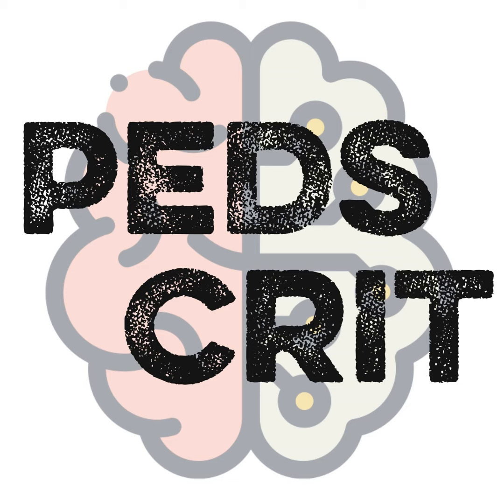Central, you're not at all limited. In the central, you're going to be a right atrium and aortic arch cannulation, right? So then you're not very limited by that. Again, if it's a small baby, it depends on the patient in a certain way, but you're not so much worried about the flow or what you can support in a central cannulation. But in a peripheral, the weight of the patient matters, the size of the patient matters.